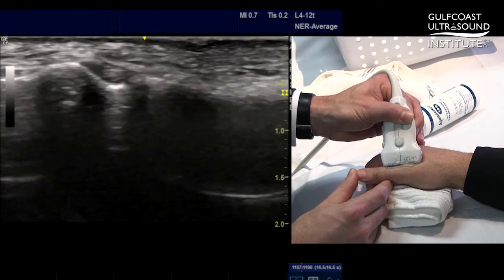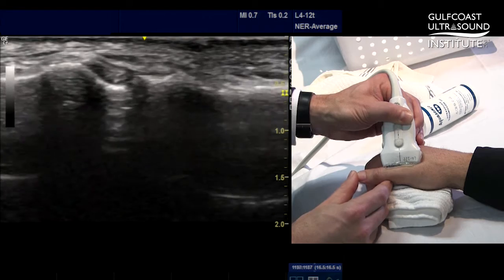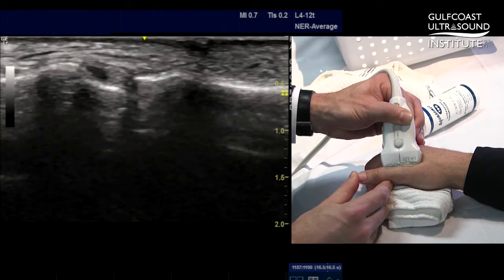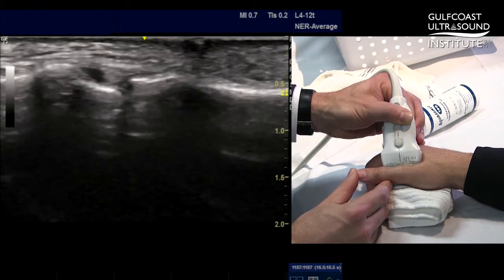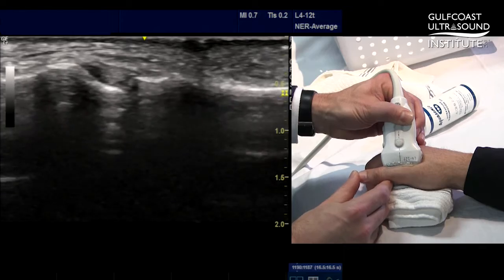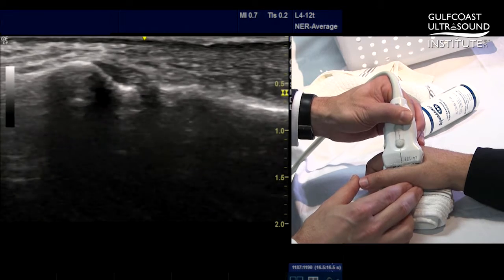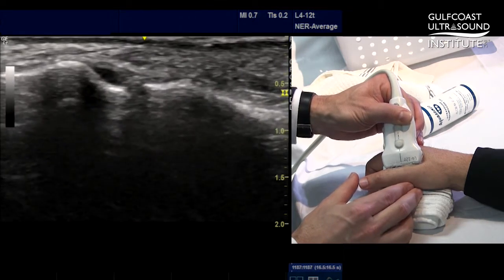This is important when looking at an ulnar collateral ligament tear. If there is a displaced ulnar collateral ligament tear or Stener lesion, this aponeurosis would be interposed between the displaced collateral ligament tear and the tear at the site of the proximal phalanx. One other dynamic evaluation to consider is slight valgus stress placed across the MCP joint.